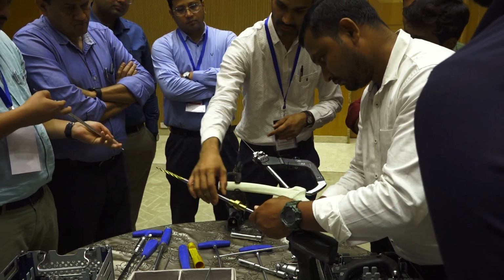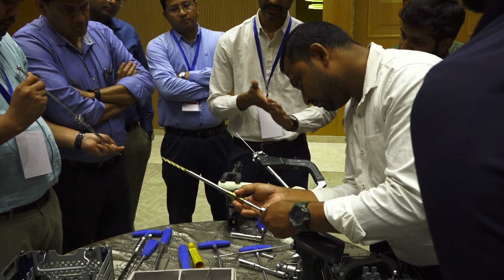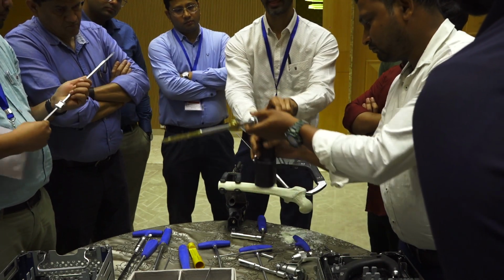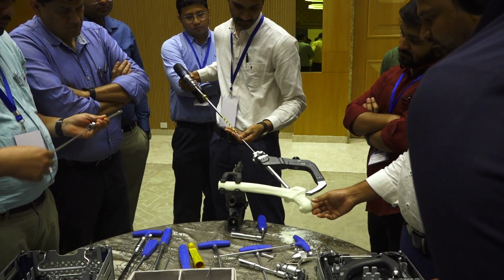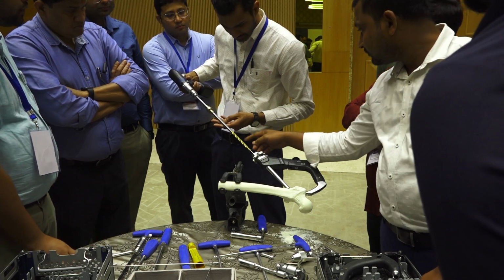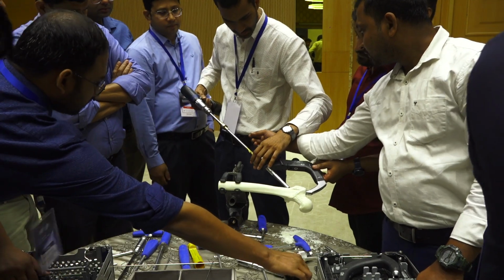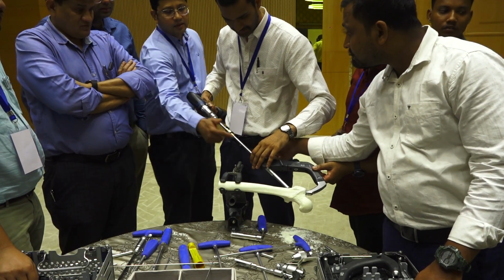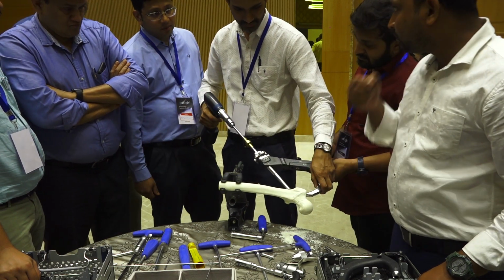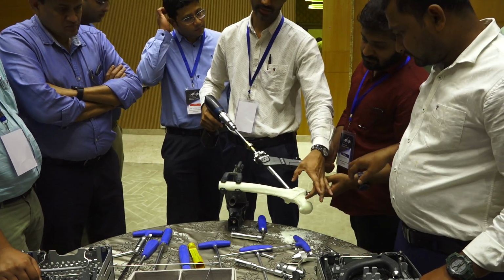According to the measurement of this guide pin, you set it here at 85 or 90 whatever, and then you drill. This is diameter 10 mm, 10.3. This one is 6.5. Look at the product manual for more than 6.5. And here also there is a stopper. You have to fix it according to the blade length.